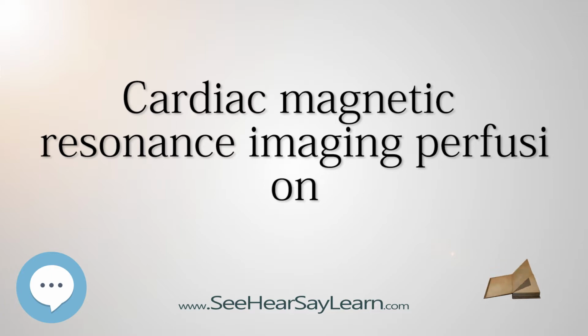It may be seen on both the rest and stress scans, in which case it is called a matched perfusion defect and is probably due to an area of scar from a previous myocardial infarction. If it is only seen on the stress scan, it is called an area of inducible perfusion defect, ischemia. The position in the left ventricle of the perfusion defects is described using the AHA 17-segment model.